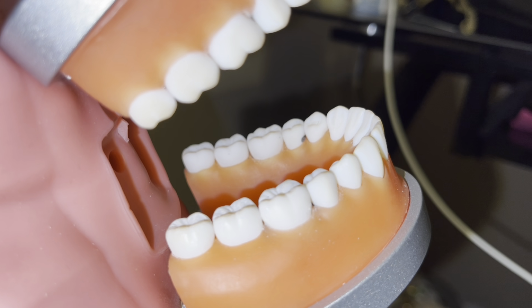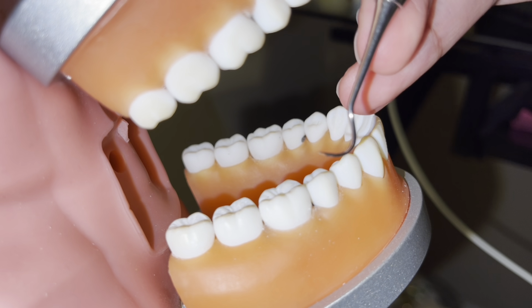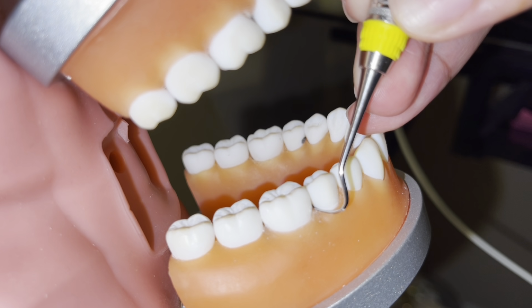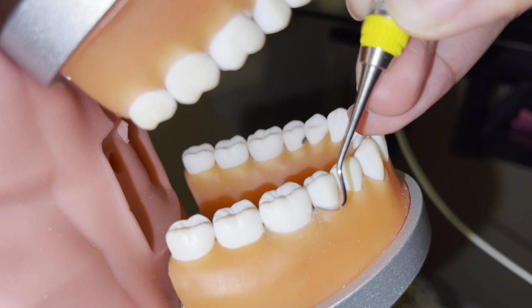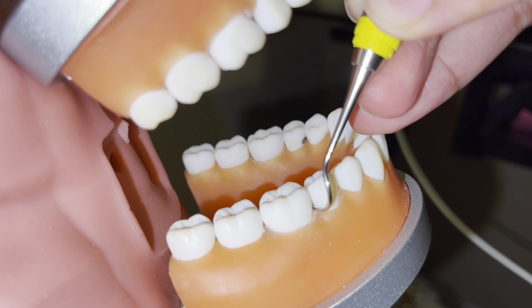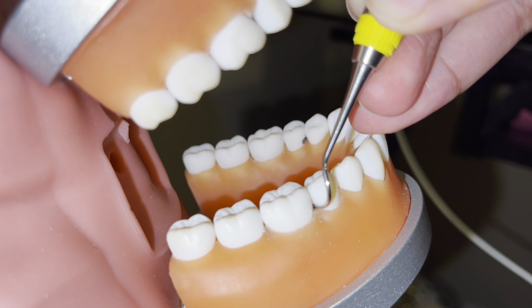And then same thing for tooth number 29. You want to start again at the distal buccal line angle, and side to side in the interproximal, up, down.